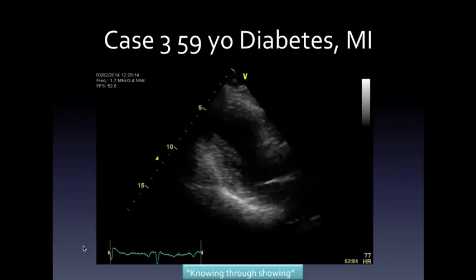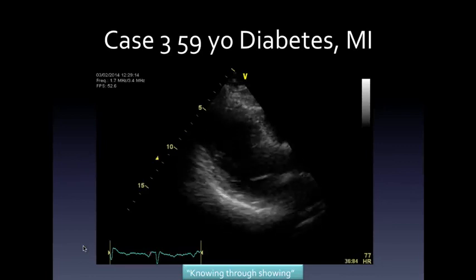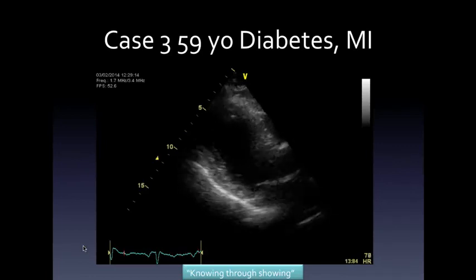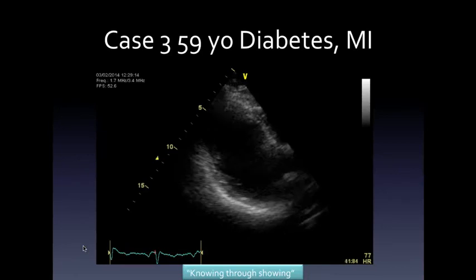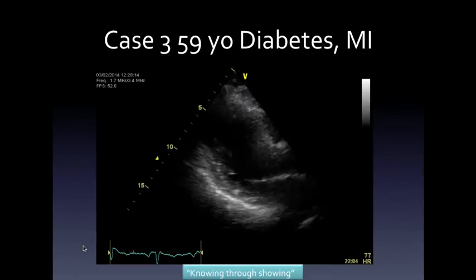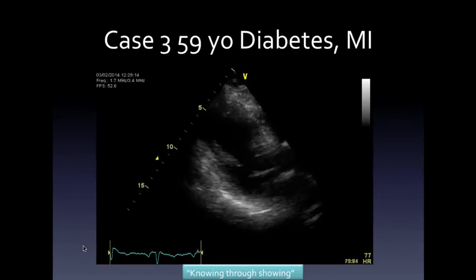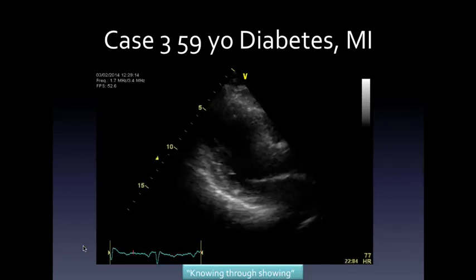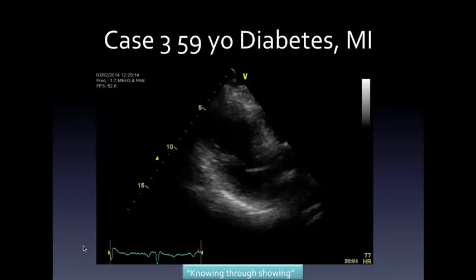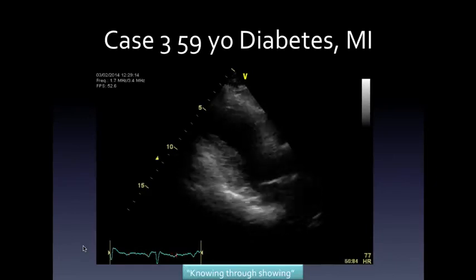He had rising creatinine, impaired hepatic function, congestive cardiac failure with bilateral crepitations, an elevated JVP, a gallop rhythm, and an ECG that showed persistent but probably fixed ST segment elevation. So, as a doctor, you'll know all that. So it then makes interpreting the echo very, very easy. And that's the point I make. As a clinician, we can put all the pieces together quite well.